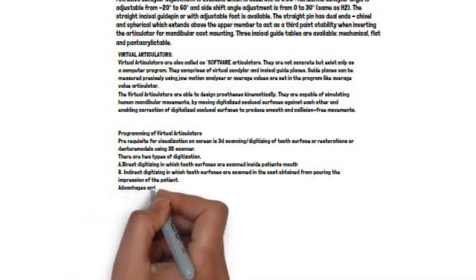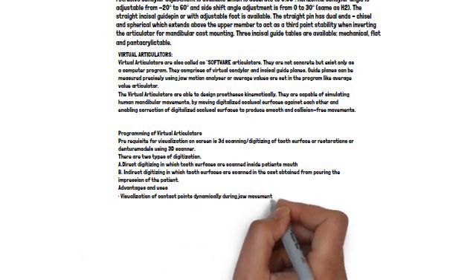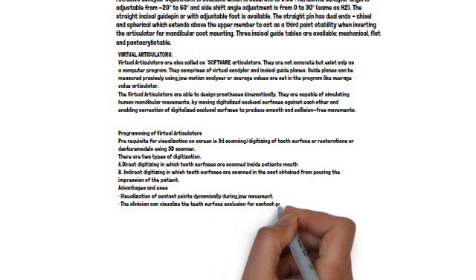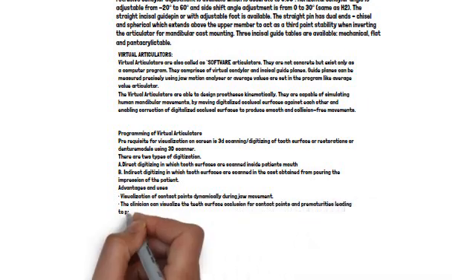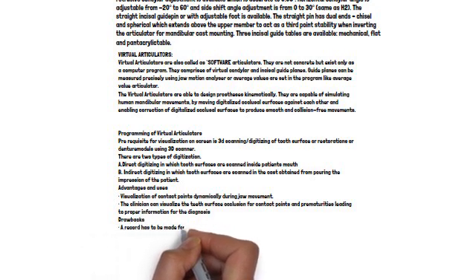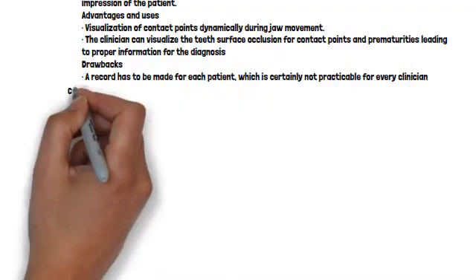Advantages and uses. Visualization of contact points dynamically during jaw movement. The clinician can visualize the teeth surface occlusion for contact points and prematurities, leading to proper information for the diagnosis. Drawbacks. A record has to be made for each patient, which is certainly not practicable for every clinician.